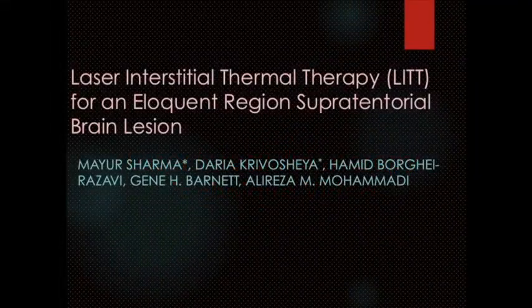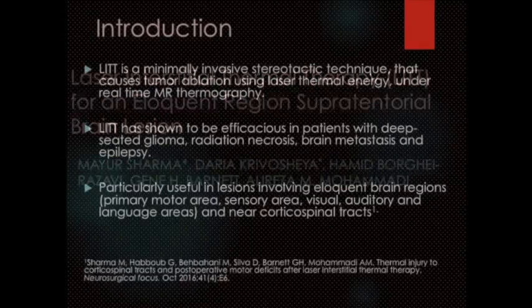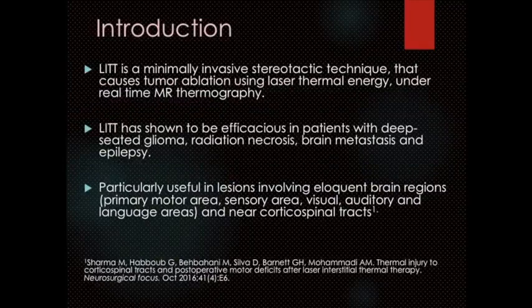The following video will review particulars of performing laser interstitial thermal therapy in areas adjacent to eloquent structures. LITT is a minimally invasive stereotactic technique that causes tumor ablation using laser thermal energy under real-time MR thermography. LITT has been shown to be efficacious in patients with deep-seated glioma, radiation necrosis, brain metastases, and epilepsy. It is particularly useful in lesions involving eloquent brain regions, such as primary motor area, sensory area, visual, auditory, and language areas.